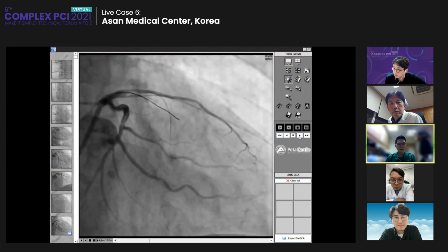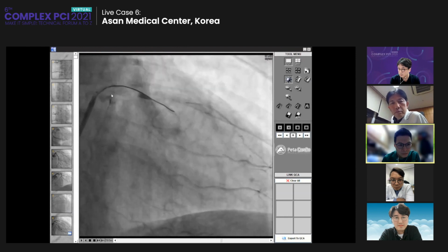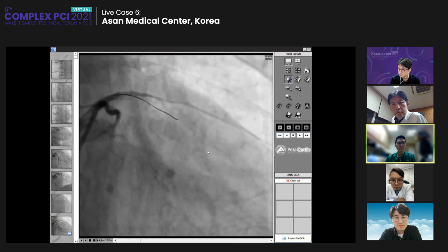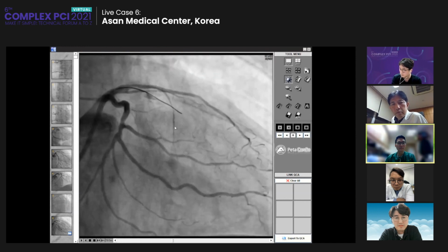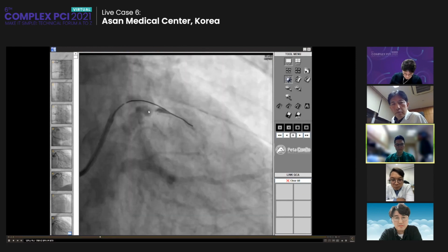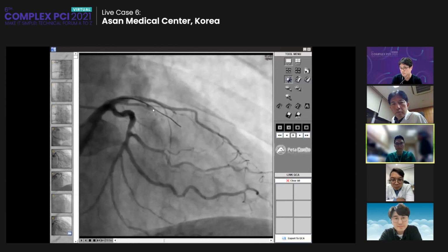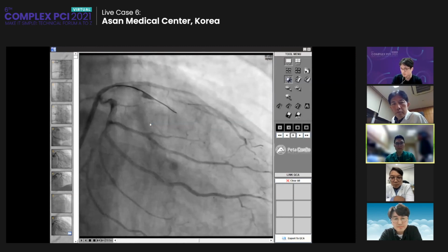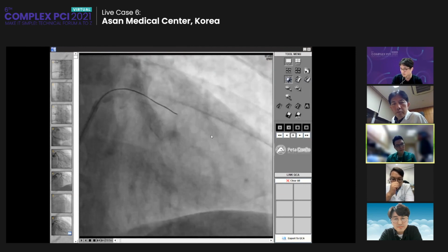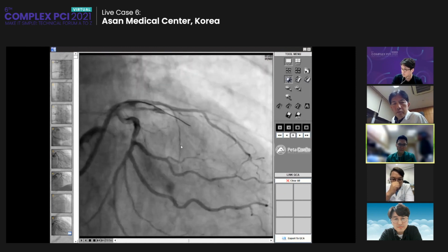In the next picture, we can see a small microcatheter at the proximal portion. They brought a microcatheter to this portion, but they are still using a workhorse wire, I think. And the wire somehow passed through the proximal cap right here. There is a contrast-filled lumen at the mid portion of the CTO, which I think we saw on the CT in our hospital, but we are not sure whether this wire is in the intraluminal position in this view.